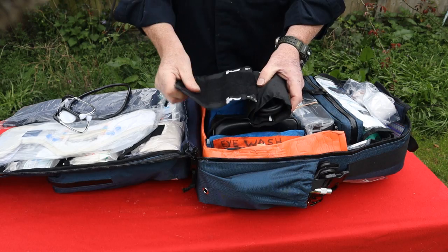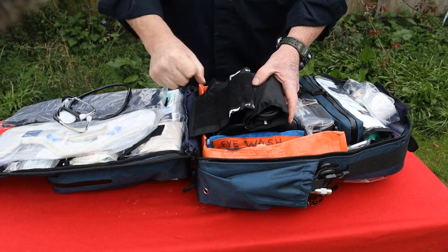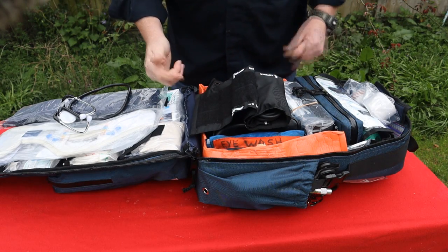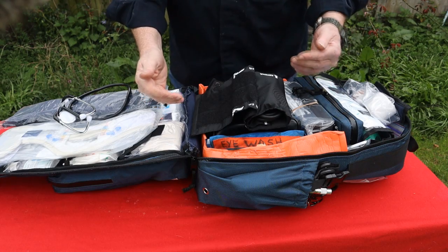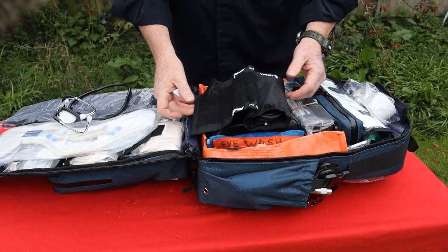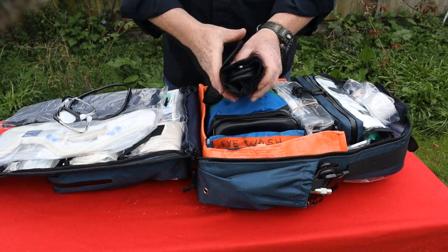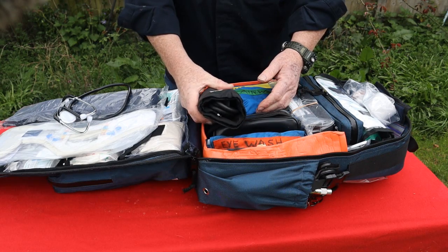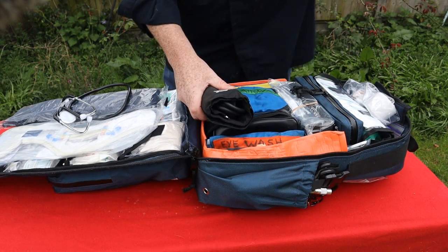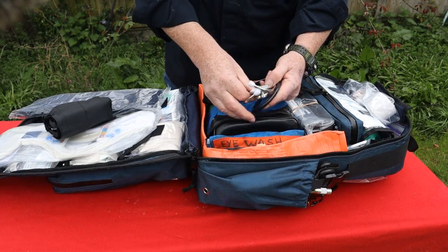So the two differences in blood pressure are systolic and diastolic. The highest one is the heart pumping the blood out, and the lowest reading is the heart at rest. For a healthcare professional, both of those things are pretty important, but more important is the gap between those two numbers. You can ascertain an awful lot by an accurate blood pressure, and no healthcare professional is going to tell you that they are going to accept one blood pressure. If you can get two 10 or 15 minutes apart, that's brilliant, gives you a good idea of whether the patient's getting better or worse. Stethoscope for taking the blood pressure, but also to listen to chest sounds.